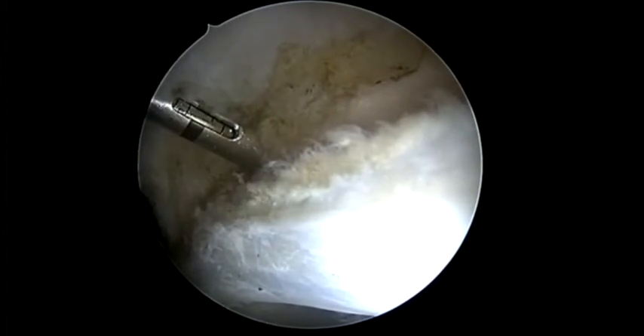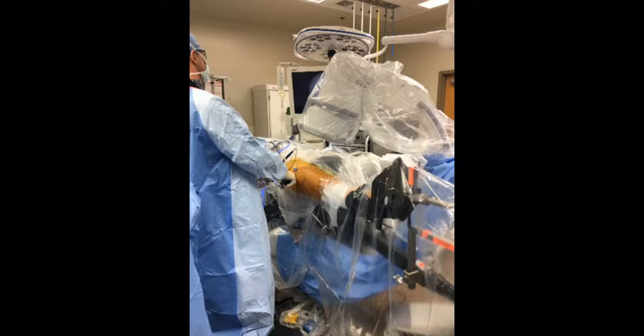We will check the articular cartilage to ensure that there's been no bubbling or damage to the subchondral bone. The drill guide is then removed and the sutures are passed through the labrum and tied down.